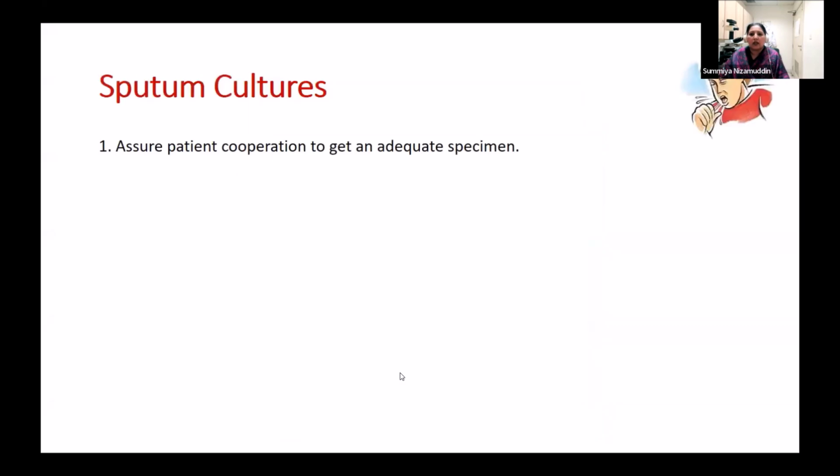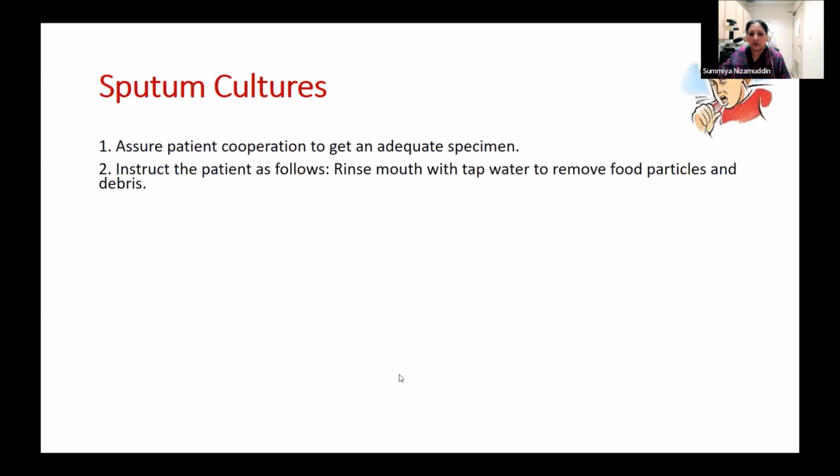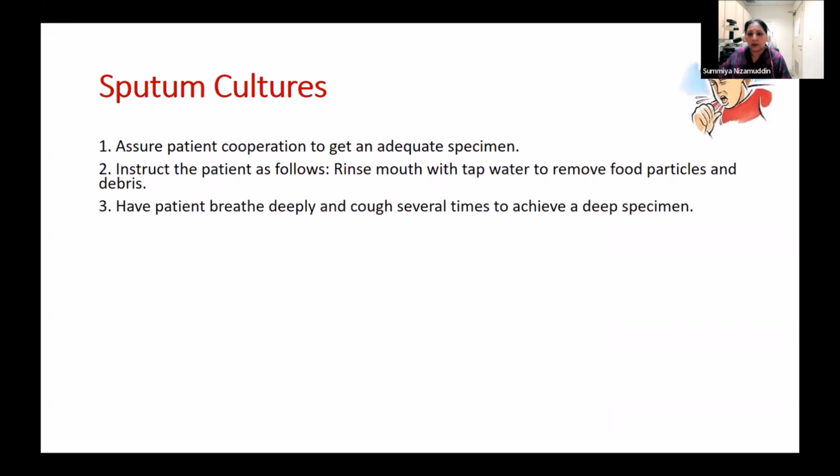ओके. Sputum cultures, so sputum culture के लिए भी there are certain recommendations. It's always better to advise the patient to rinse his mouth before he's submitting the sample. It's always better to advise the patient that he needs to submit sputum or phlegm. For cultures we don't need saliva. तो अक्सर ऐसा होता है कि sputum के cultures में जो है पेशेंट हमें सिर्फ saliva अपना देते हैं, बलगम नहीं आता, तो पेशेंट को प्लीज़ एडवाइस ज़रूर कीजिएगा कि बलगम के सैंपल हमें प्रोवाइड करें.